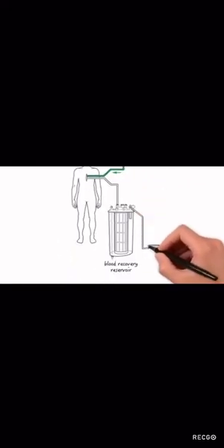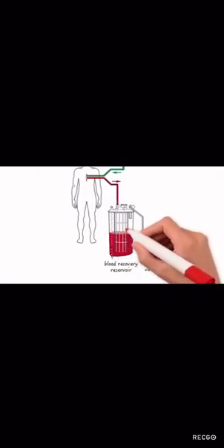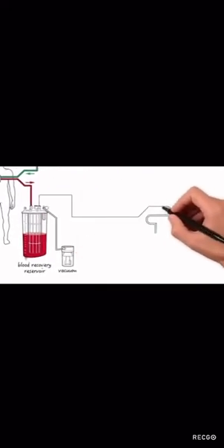Vacuum is applied to the reservoir via a vacuum source, most often the X-Vac. The anticoagulant joins with the blood at the point of aspiration. This avoids clotting and also reduces activation. Once enough blood has been collected, the wash set needs to be installed.